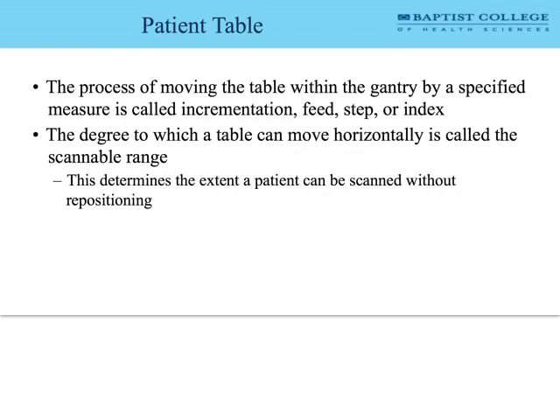That's a powerful thing if you think about, especially for guiding surgeries or guiding stereotactic procedures or radiation therapy planning or interventional procedures, is I can say, okay, I know that this point in the patient's body is X number of millimeters superior to this point in the patient's body. That's really important.